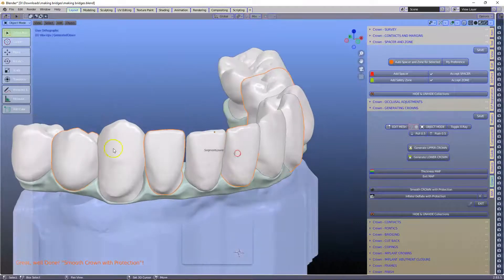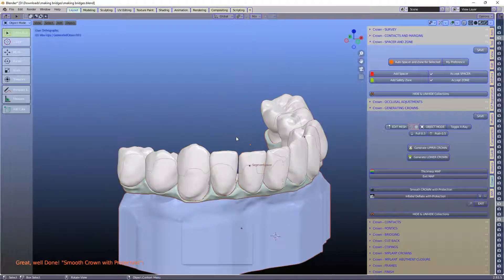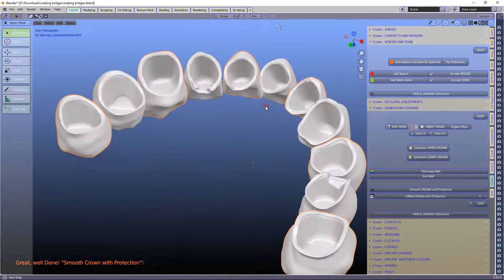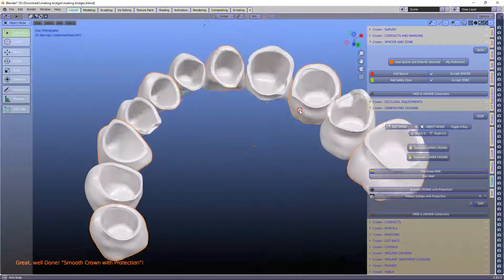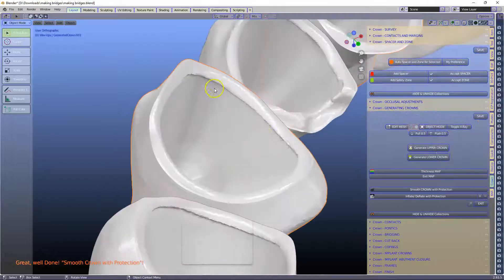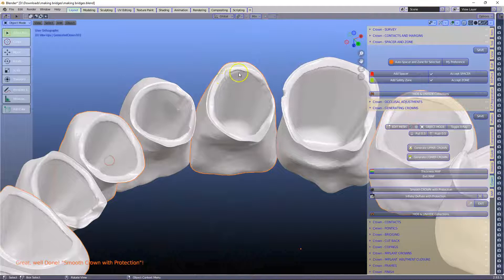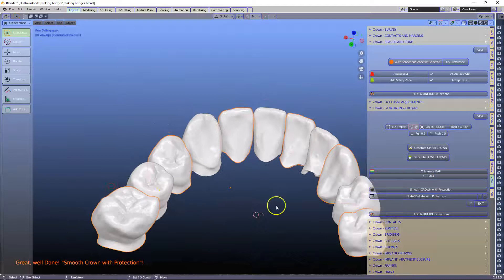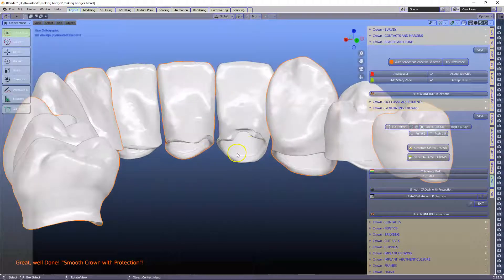Now these are all joined, so you have to use the separate button to separate these. Let's have a look at the inside — Control+I, hide — and we've got the insides all cut out. We can see how it has made our die spacer cut on the inside on each and every one. It's quite a big cut, so I'm quite excited about this. Awesome — okay, thanks!